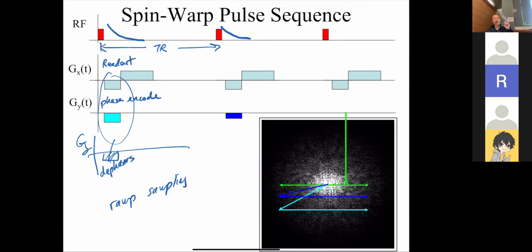So that would just take you out to some place in three-dimensional k-space. You can imagine doing that, and it would just take forever, right? But people do that, and we'll get into that. Okay, that's great. Then if we added some additional phase encode dephasers, we could acquire more lines. And that's the basic idea behind an MRI pulse sequence. We're just going through k-space.